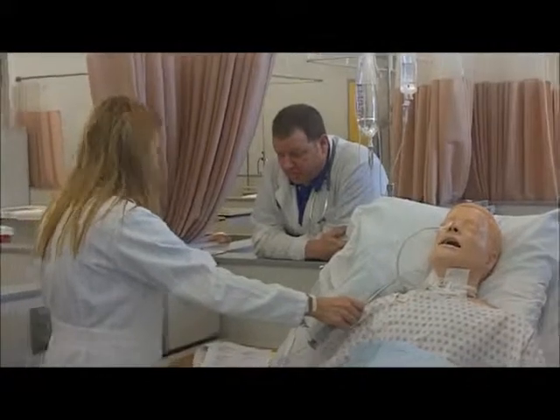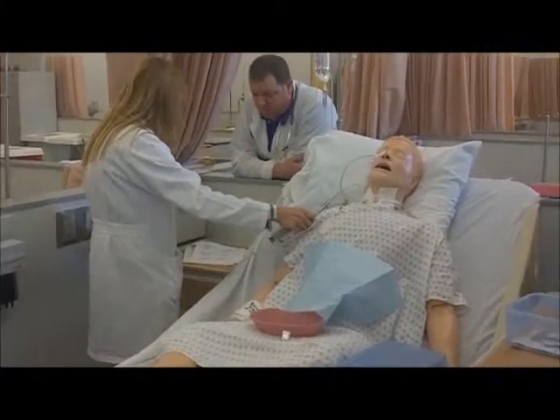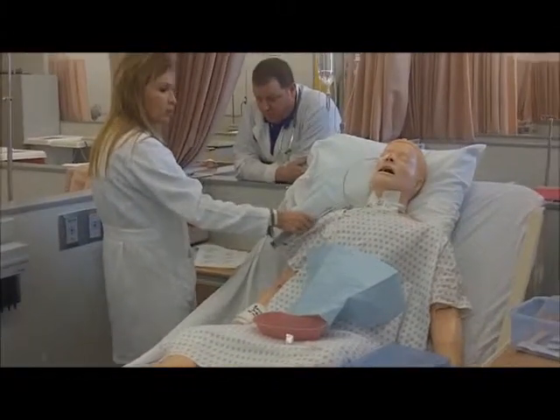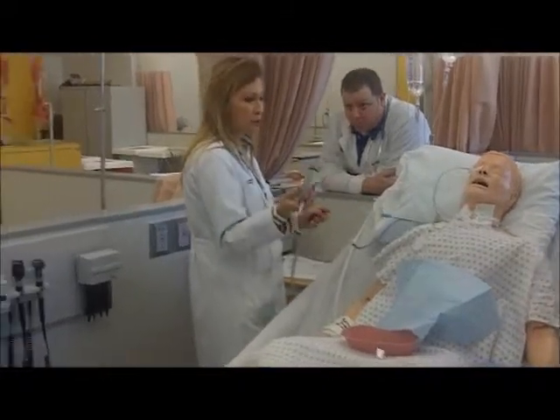If you're not getting secretions and this is connected and it's empty, there's something wrong. It's either not placed properly, or it's just clotted. That's when you need to irrigate.